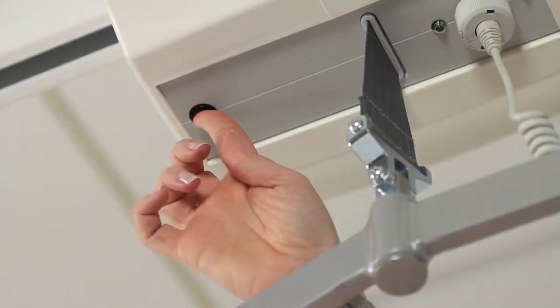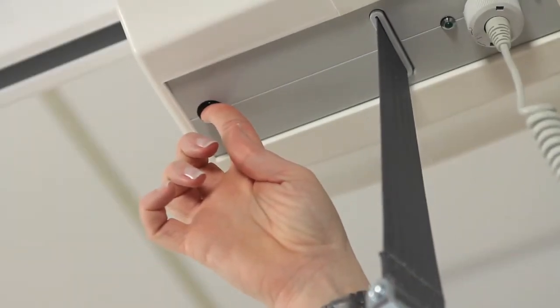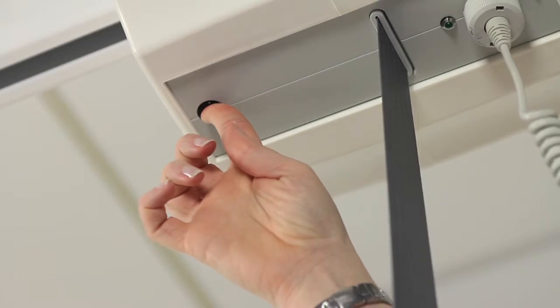Press the red button on the underside of the lift to operate the electrical emergency lowering. Lowering stops as soon as the button is released.